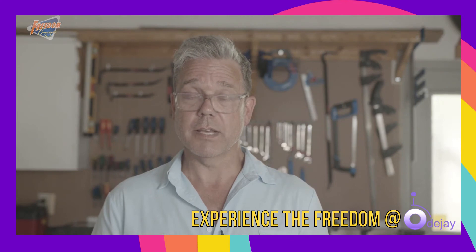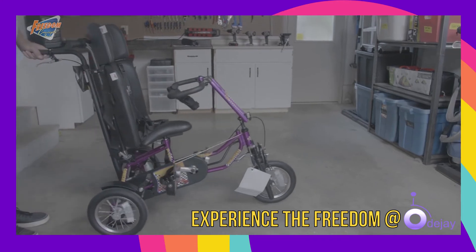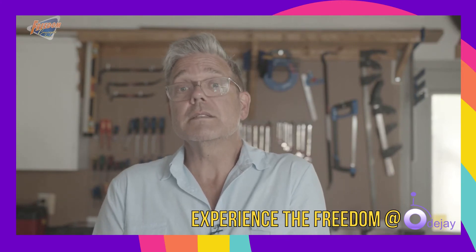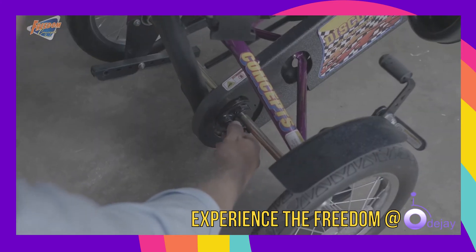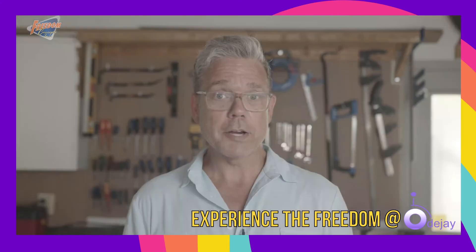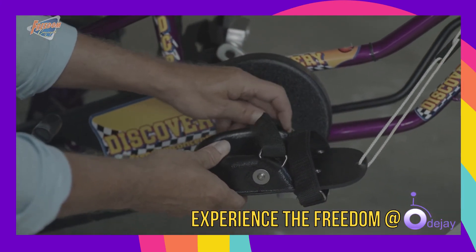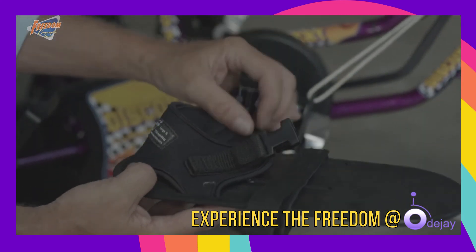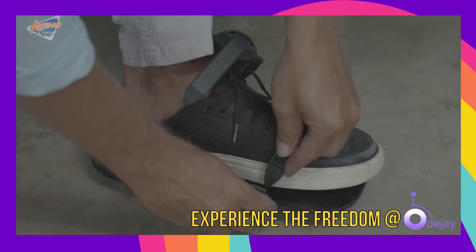We have a variety of gearing options available. The most common style on this cycle is direct drive, which means that when the bike is moving, the pedals are moving. One of the newest features available on our bikes with direct drive is the on-off pin reciprocator. By simply pulling the pin, the pedals are disengaged and the rider can rest their legs. To re-engage pedaling, simply push the pin back in. To keep the rider's feet secure, we have a variety of footplates available. This particular bike has the molded ABS footplates with a nice heel cup that the rider can use to generate force. We also offer adjustable neoprene straps, and for those riders who have difficulty keeping their feet in place, we have the ratcheting foot straps.